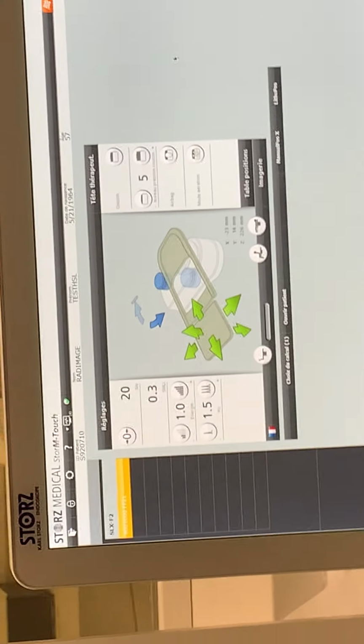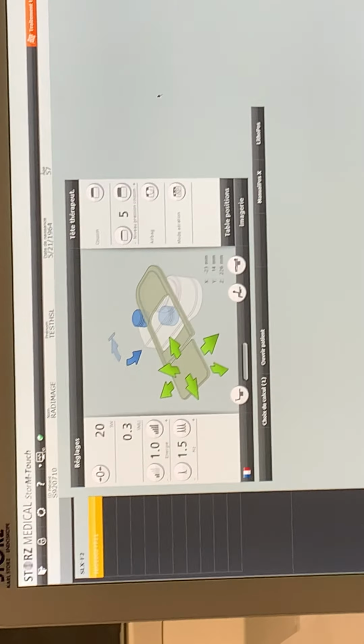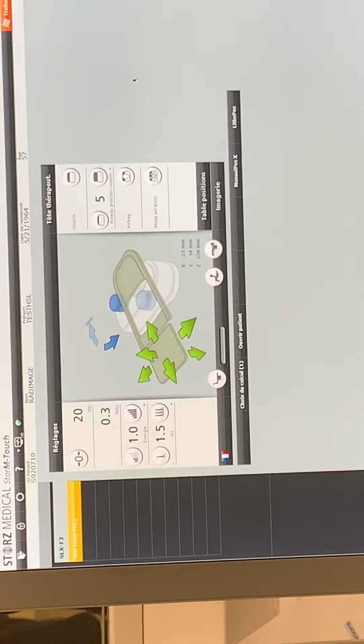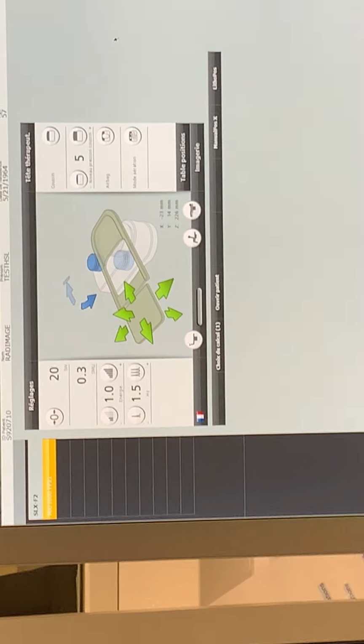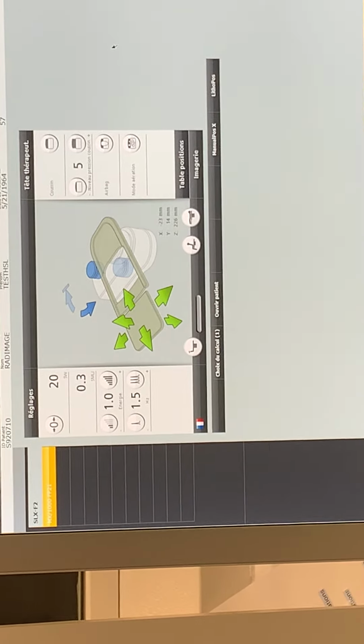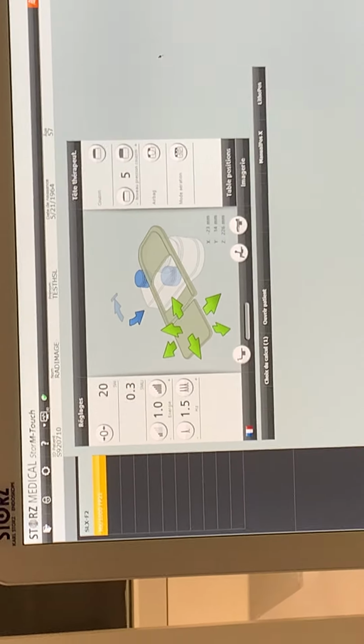You need to work together. You need to ask them as well. But as you are the doctor, you need to know what your technician is doing. So, if you only say, okay, I believe in my technician, but he forgot the silicone oil, you will have a bad treatment in the end. So ask him, do you put the silicone oil on it?